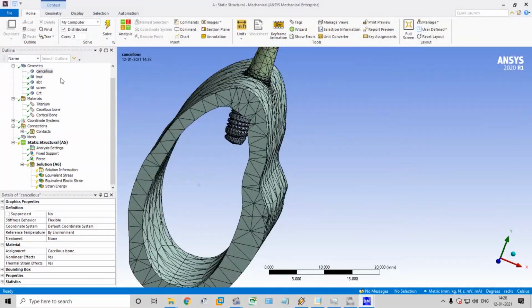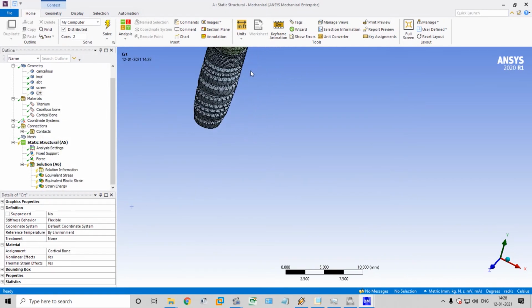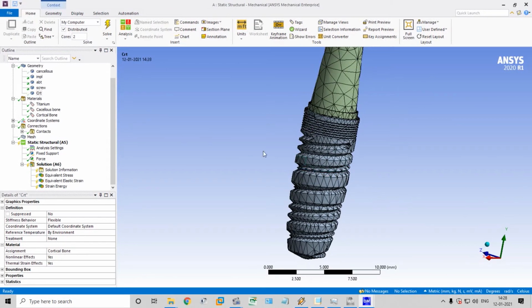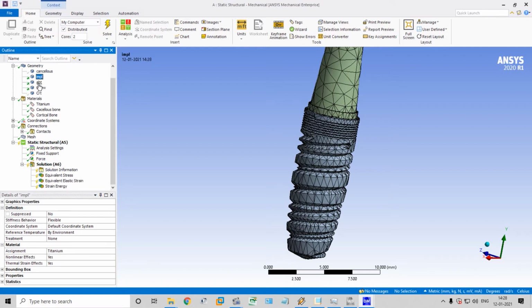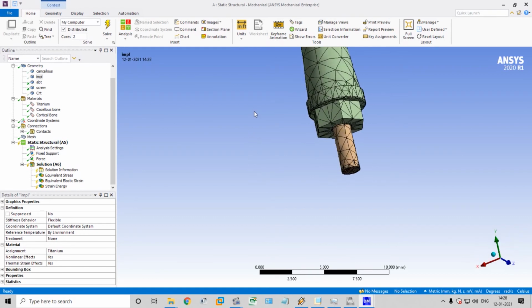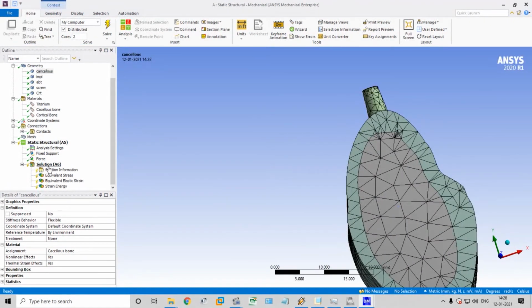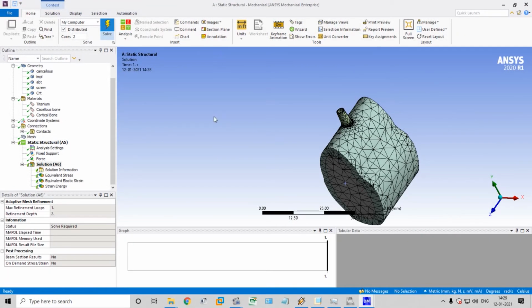You can see below, cortical bone. Just hide it. You can see the small elements. Okay, just hide, and you can see. Okay, show all the bodies. Okay, next is the solution. Click solve. That's it.